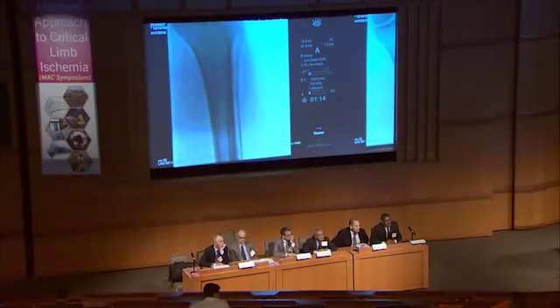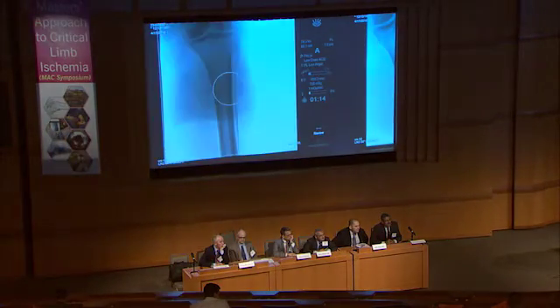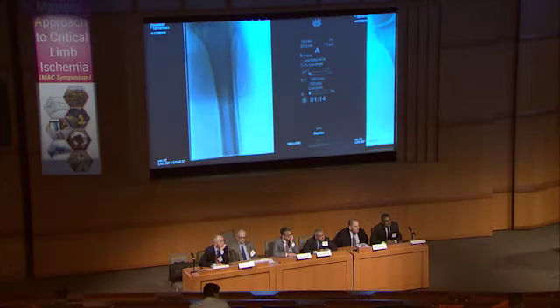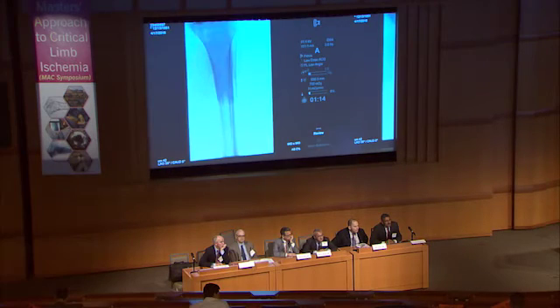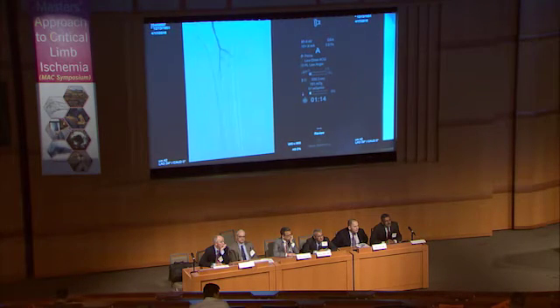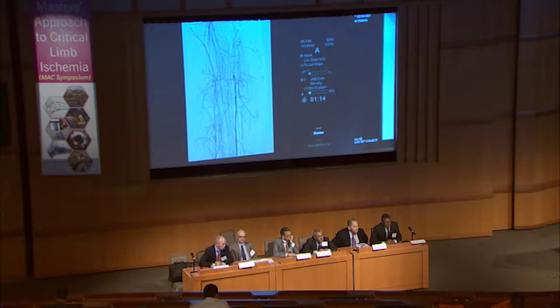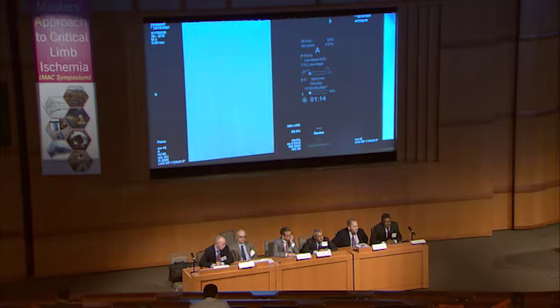Dr. Walker, please. Yeah, Ali, how surprised would you be, however, if once we create outflow and now we have a low resistance runoff, where before we had a very high resistance runoff with all infrapopliteal vessels occluded and the popliteal occluded, how surprised would you be if you saw much less flow in the AV malformation coming from the profunda at this point, now that he's establishing true outflow?